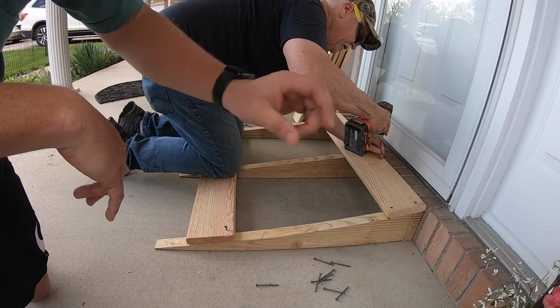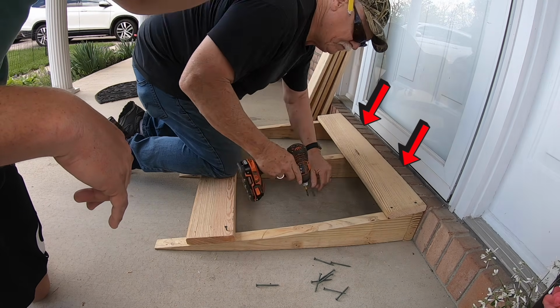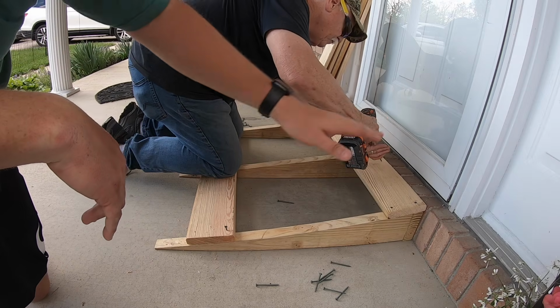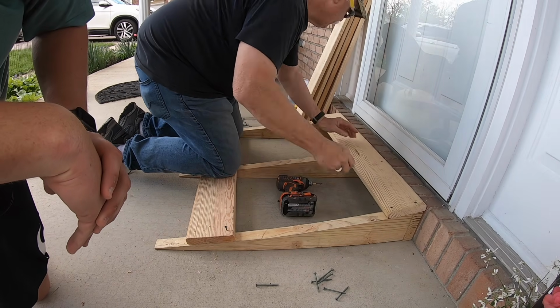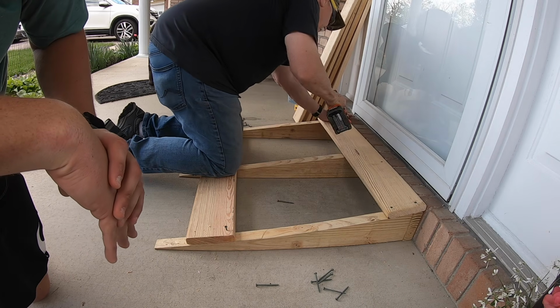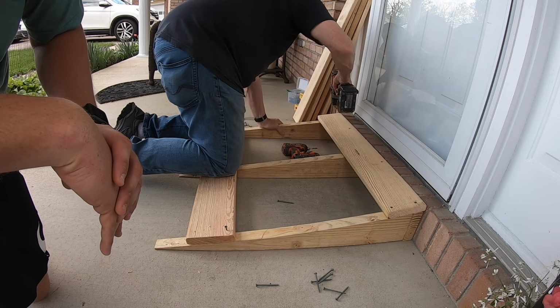Then you're also going to want to put a few in the top onto the header, and that will help give extra hold to the top and make sure you're not moving at all, because that's where a lot of your wear and tear is going to be for this wheelchair ramp, and we want to make sure that is really snug down in there. So the top board will actually have 8 total screws, but all the other boards will only have 6.